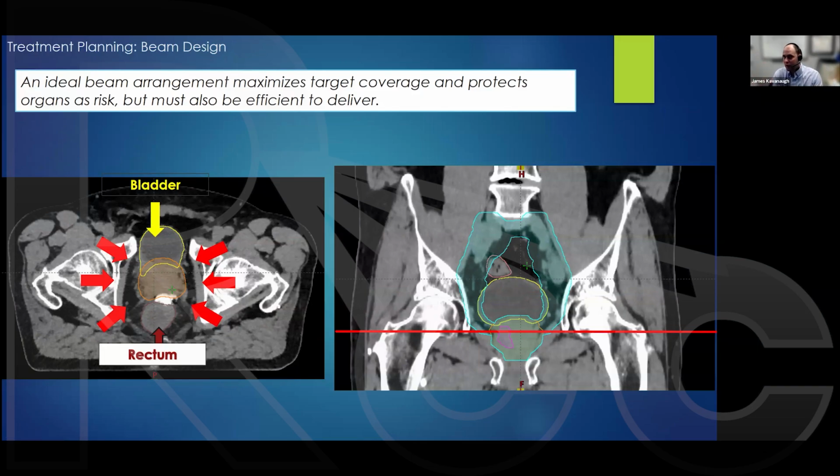So if we're in the VMAT realm, having full arcs allows the optimizer at each level to determine how much fluence should be coming from those particular directions. If you're working in the static field IMRT realm, I would recommend looking at the full target and not saying, oh, I don't want an anterior beam because it's not beneficial for this particular level. It may be beneficial for other levels, and thus you're giving the optimizer the ability to utilize its skill, its design, to figure out fluence at the particular levels, superior-inferior, of the target and OAR combination.